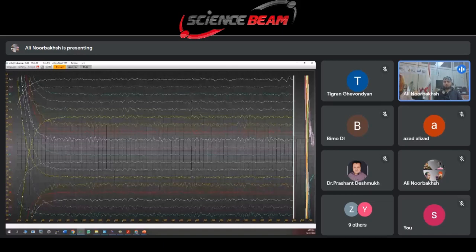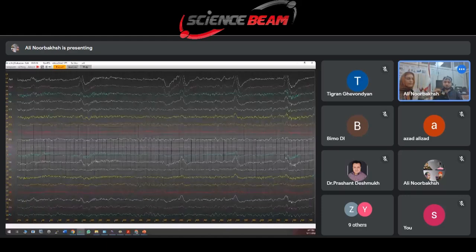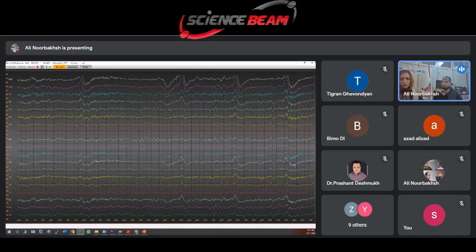Okay. After 4 minutes, we should stop the software, okay? But now it's a 2. But I stop it. Do you have any question about the device or software? Wait a minute, please. Do you have any question?